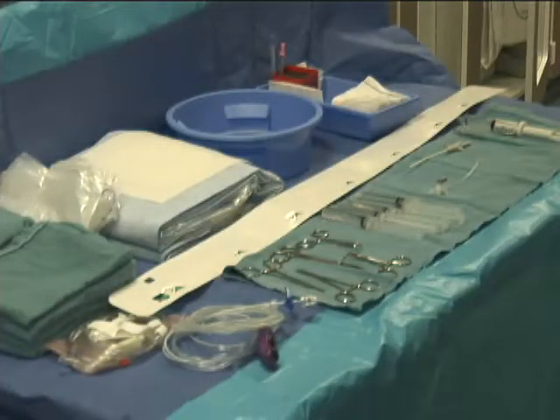Also seen here is the equipment table, which holds all of the equipment necessary to perform diagnostic coronary angiography, including catheters, needles, wires, etc.